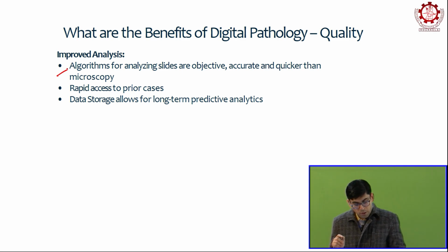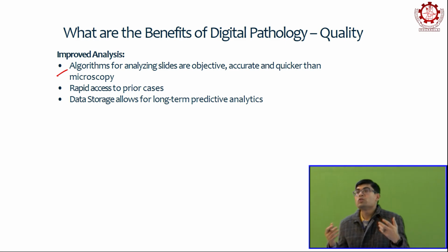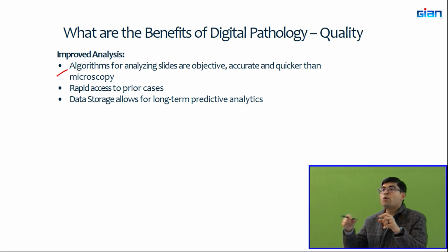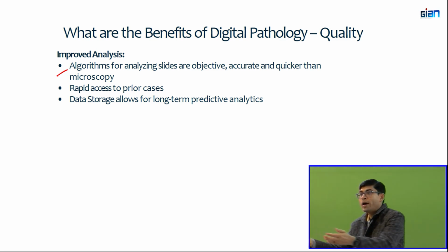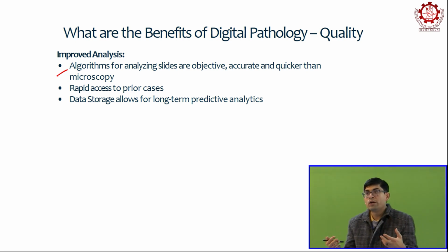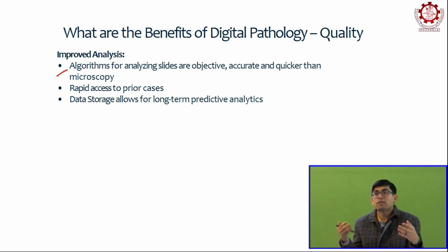And there's rapid access to prior cases. A lot of times pathologists might be interested in looking at previous slides. If they want to look at previous slides, what they have to do is, let's say, unmount the current slide, find out where in the rack the previous slide is, mount it, and then view it, right? So there is some time involved there. I'm not saying that it's a lot of time, but there's some time involved there, right?